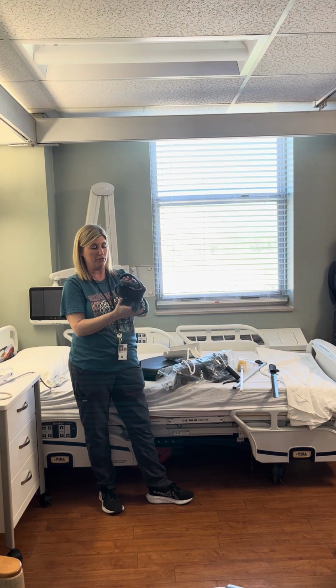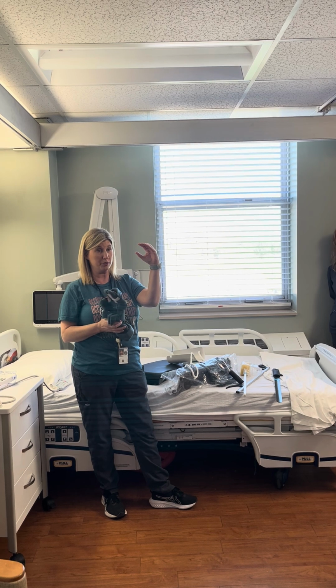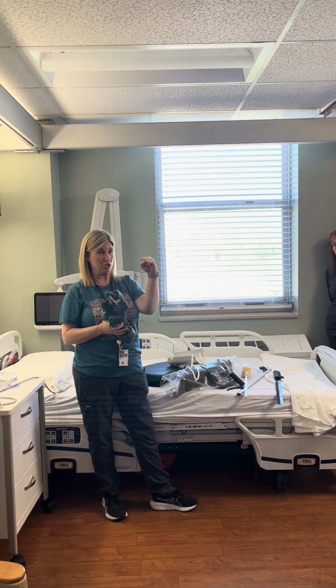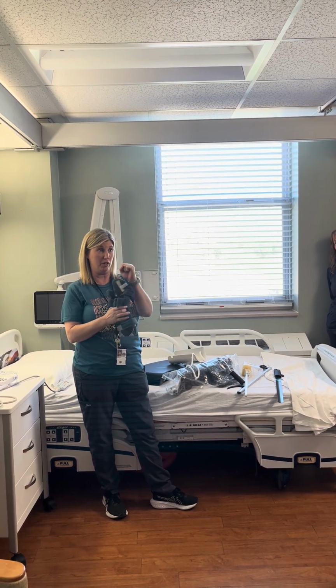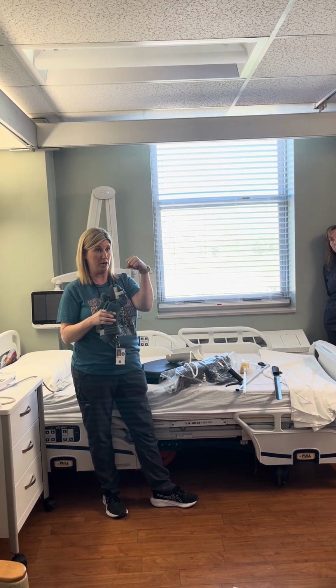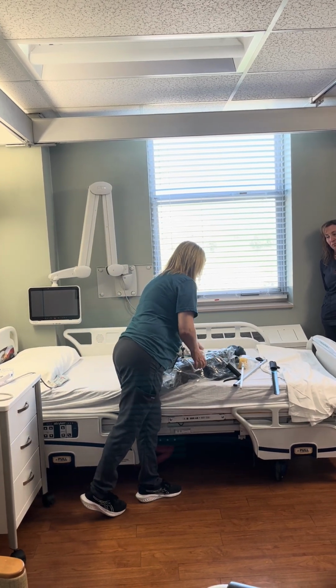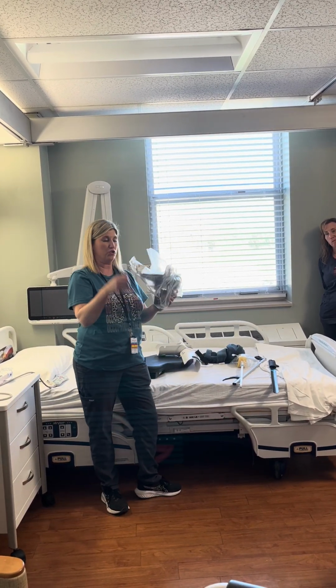This is so if they have tone or tightness, their hand stays in a nice neutral position. Otherwise, it would be crunched up like this all night, and that actually hinders their recovery because all those muscles and tendons shorten up, and then they don't want to straighten back up for us. You will also see these little arm troughs on the chair.